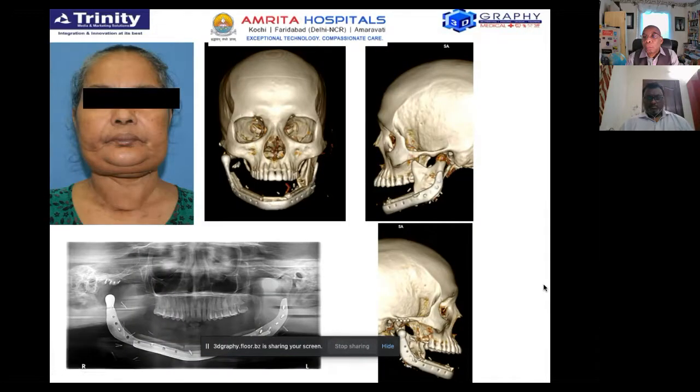That's her after the procedure. So what we usually do is, if the mandible is dentate, we keep the patient on intermaxillary fixation for a while, at least on elastics, so that the joint is trained and they know how to open and close the mouth. So that is kind of a physiotherapy that they usually undergo at the end of the procedure.